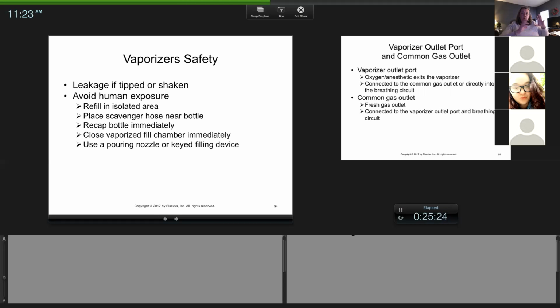But if you hit a door jamb and it tips or falls over, it can get damaged and you definitely have to tell somebody, because it can damage the inside. You might deliver unsafe amounts. And again, you might not want to fess up to that, but for the safety of your patient, you have to let someone know that it tipped.